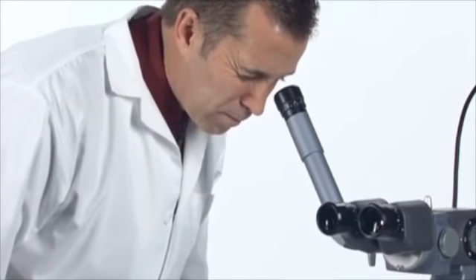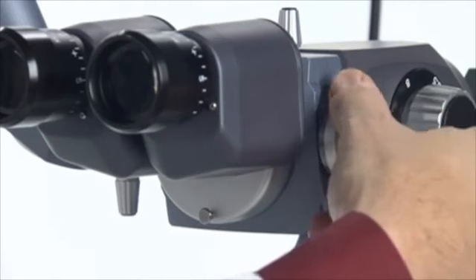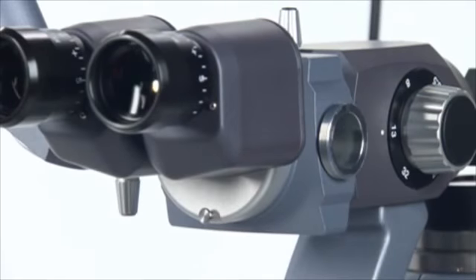In addition, some slit lamps and microscopes require an auxiliary eye safety filter to protect persons observing the procedure through an observation tube. To determine if an auxiliary eye safety filter is required, review your slit lamp or microscope operator manual or contact the manufacturer.